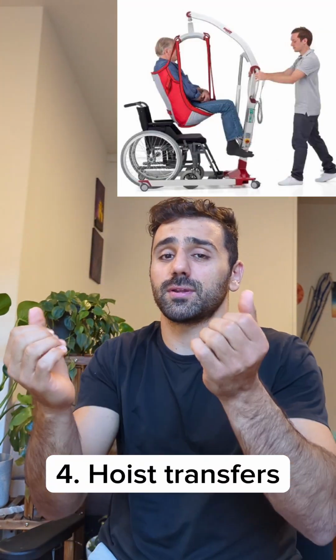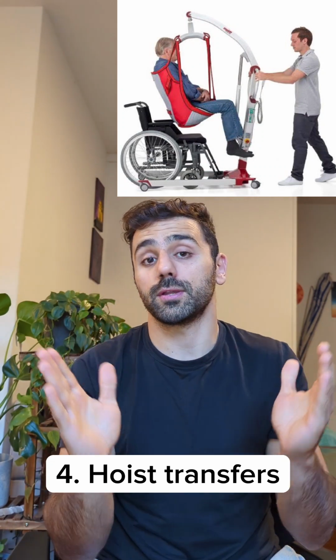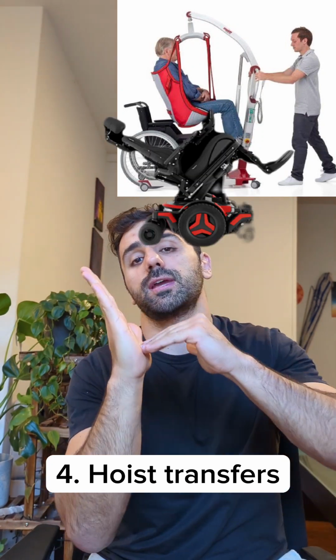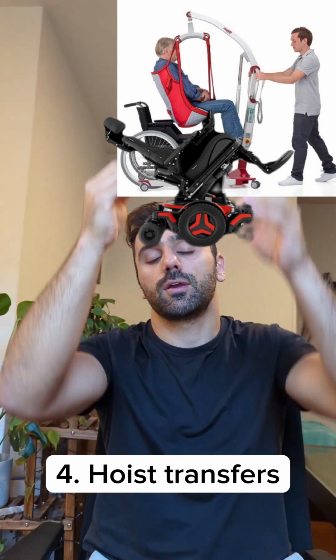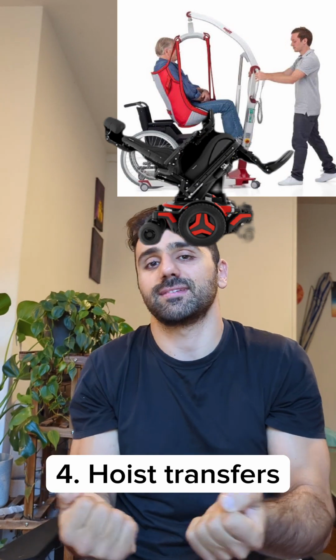Number 4 is hoist transfers. It's very hard to get someone seated all the way back into the chair when we're hoist transferring them. So what we can do is we can tilt the chair so the chair matches the angle of the sling. So when we lower the client into the chair, it's much easier to get them back into the chair.